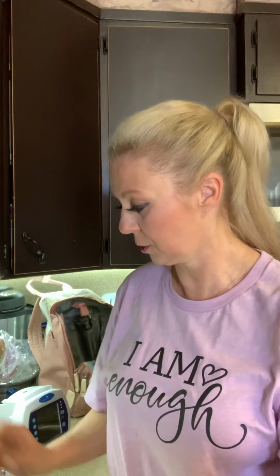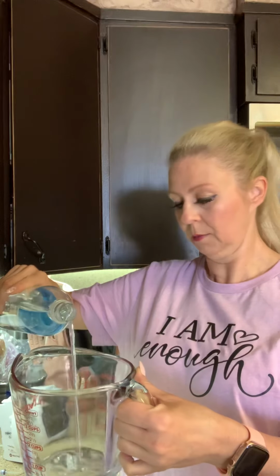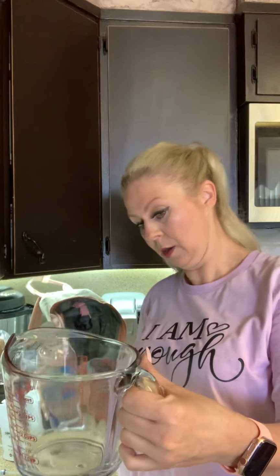But I just wanted to show you quickly how a person with a feeding tube makes their meals. First of all I get electrolyte water, and I have to measure out 2 packets or 1 packet, depending on what I am having for the day. Right now it's daytime, and I do 2 packets of powder.